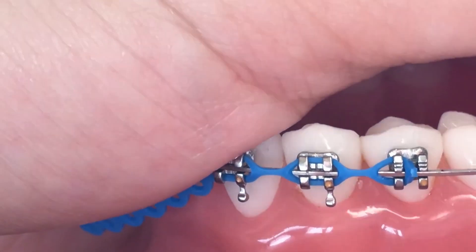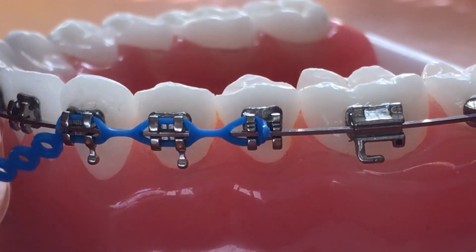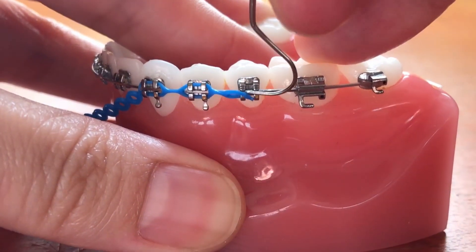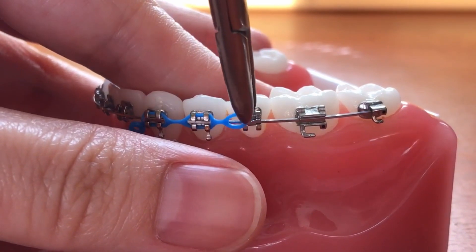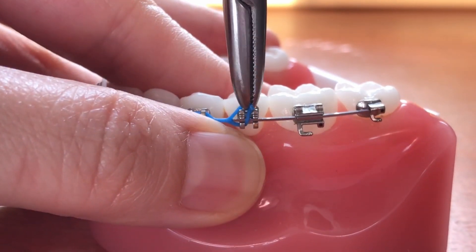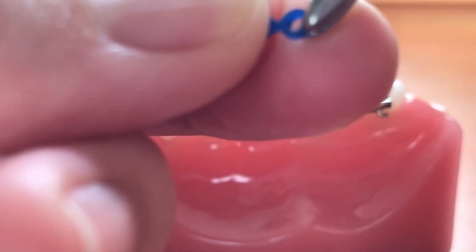It's supposed to look like this, where only the front half of the bracket is engaged with the power chain. If by accident you release the whole power chain, that's okay — just put it back on again, but only to the front half of the bracket. Do not engage the whole bracket.